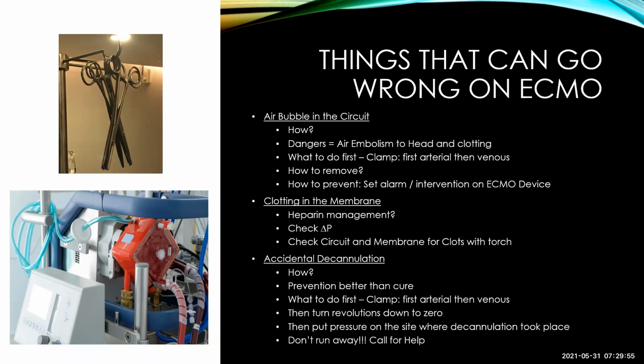As soon as you see that the chamber is getting empty, make sure that you close off that line. If you have air in your lines, don't flush it into the system because it's definitely going to be picked up by my ECMO membrane and circuit. And then you're going to have air in your membrane, and the air can actually overshoot into the patient.